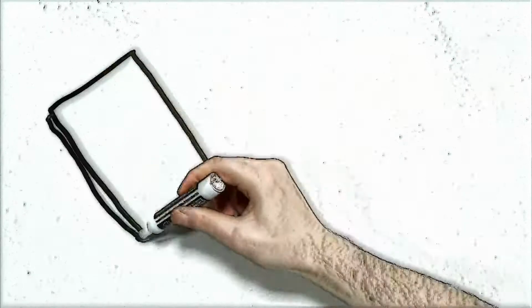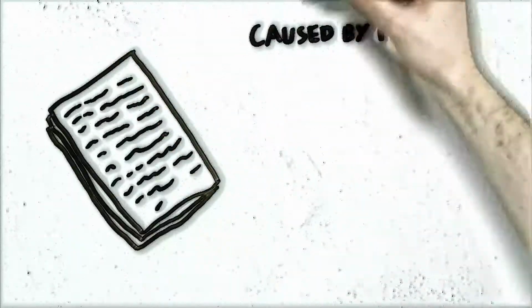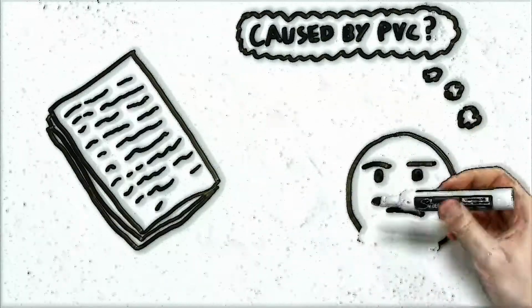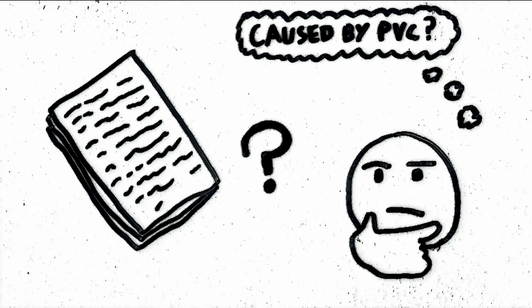After a patient gets a SAB, an investigation is carried out to determine the source. This investigation highlighted the PVC as the source of the SAB, and an audit was carried out in the ward where the SAB was attributed to. Documentation surrounding PVCs was poor, and no care plans in place, limited medical and nursing documentation.